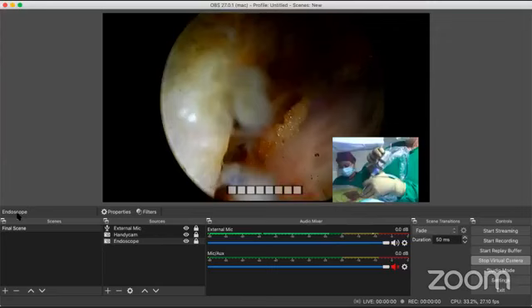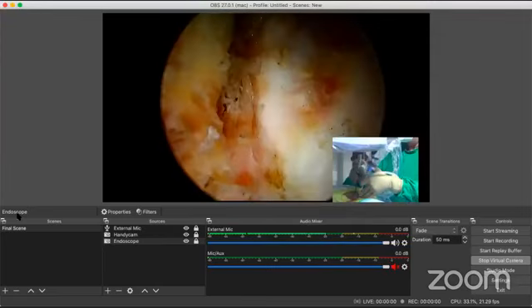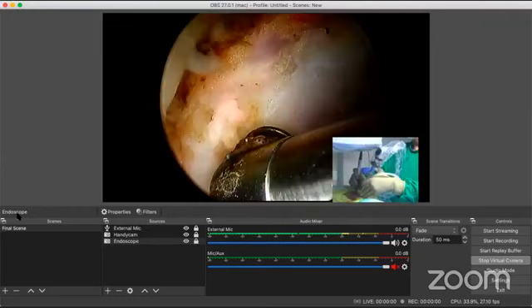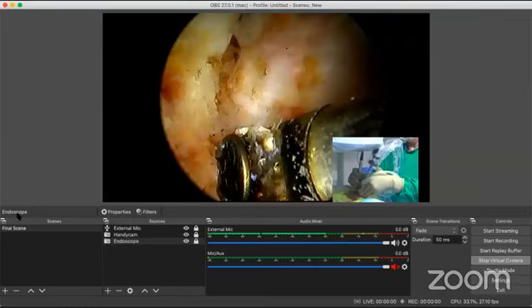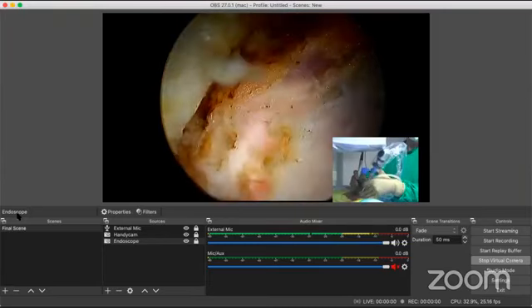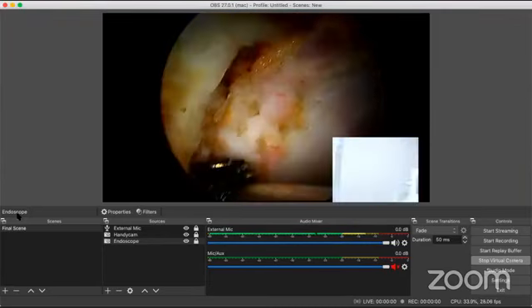Yeah, as I reduce the light, you get a better picture. Okay. And now this is the lower lamina. This is the edge of the upper lamina. This is my V point. Now take a shoot, please. Let's confirm our V point. Bingo. Okay, here we are at the V point.